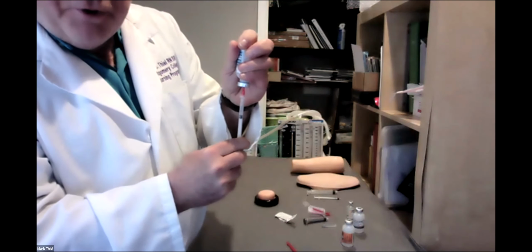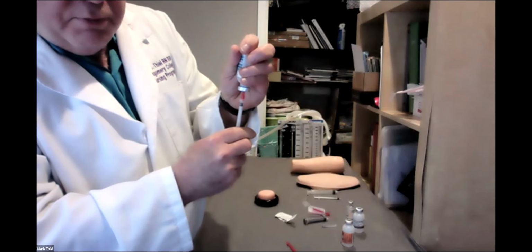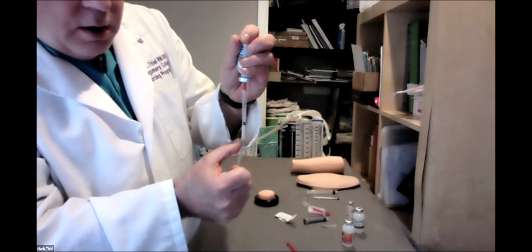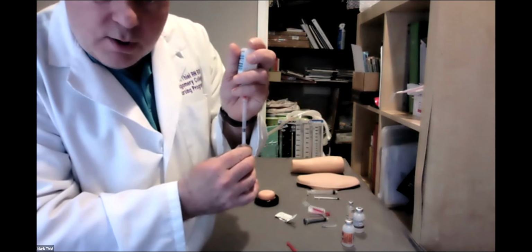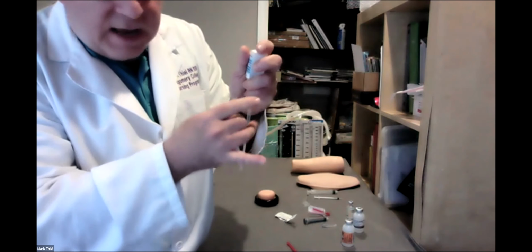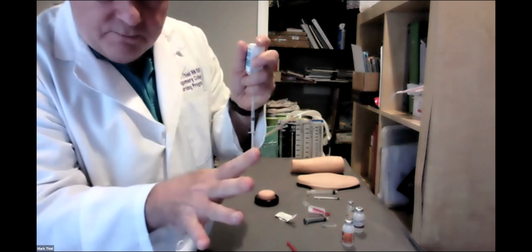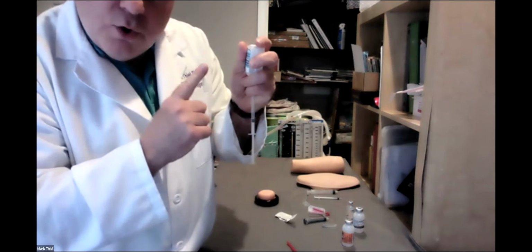Third technique: back up, push your medication back in, and draw a little bit, perhaps a significant amount, more than the amount that you need. It gives you more fluid to work with. Snap, snap, oops, snap on the barrel, and it may relieve.